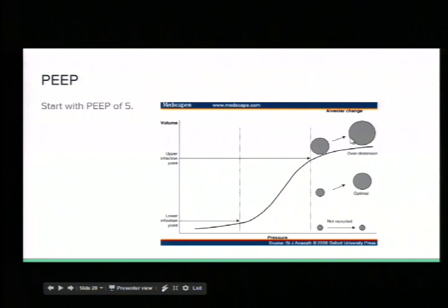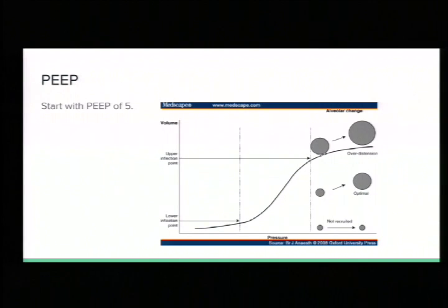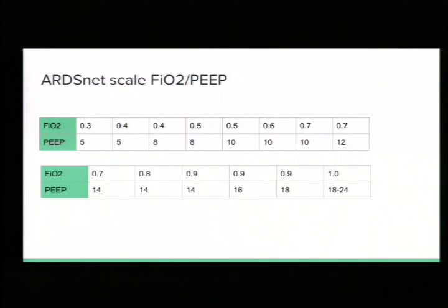You don't want big expanded alveoli with so much pressure, because then they're not exchanging gas as well either, and you're causing barotrauma. So you got to keep them in that kind of optimal with the little PEEP, keeping those alveoli always open just a little bit. You don't want them smashed down so it takes so much pressure to overcome and open them, but you don't want them sitting there almost fully extended before any ventilation goes in.